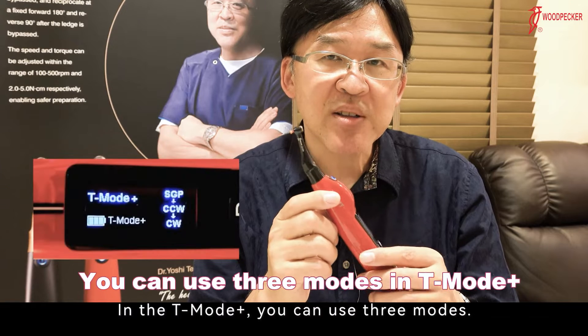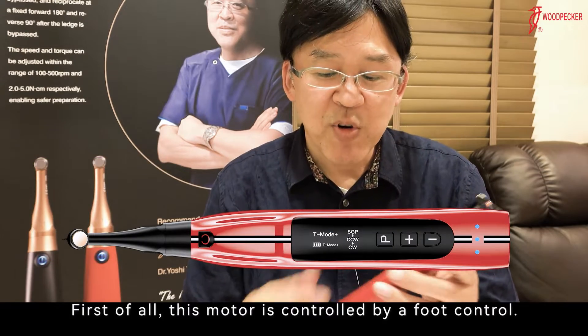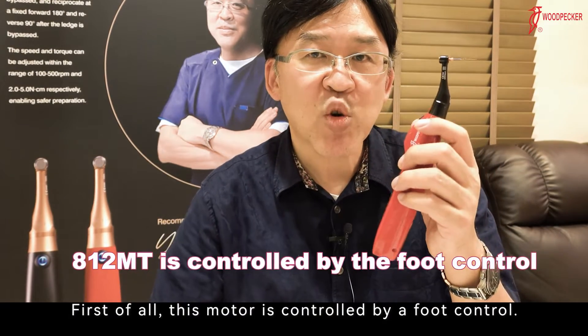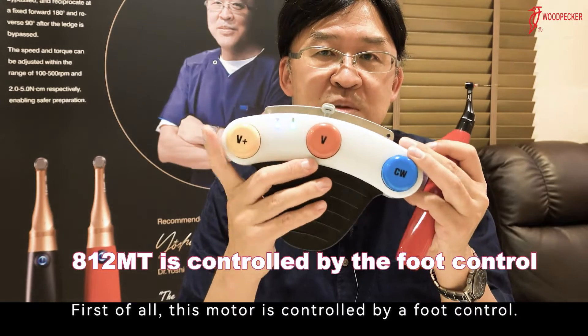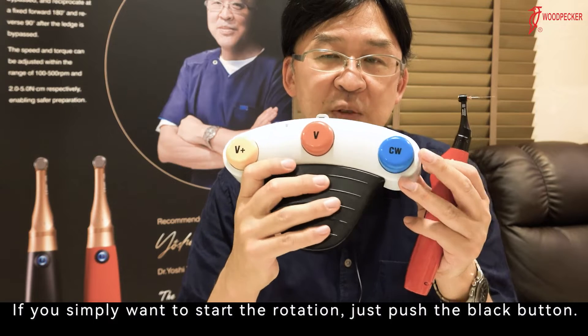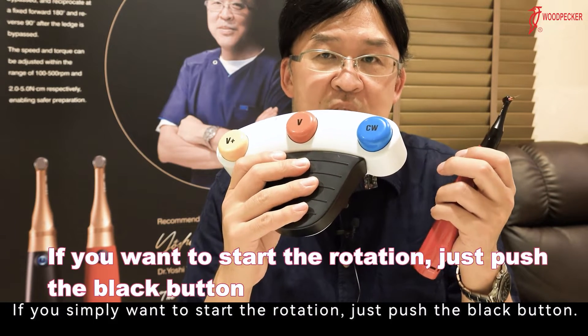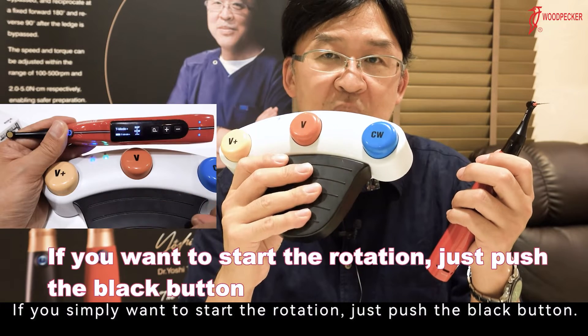In the T-Mode Plus, you can use 3 modes. This motor is controlled by the foot control. There are 4 buttons: black, yellow, red, and blue. If you simply want to start the rotation, just push the black button.